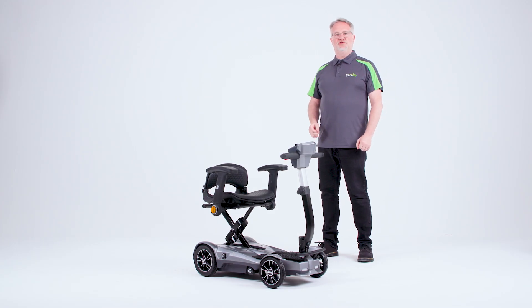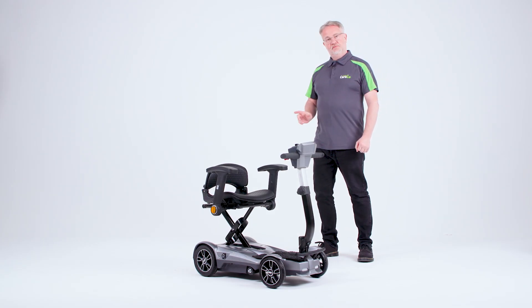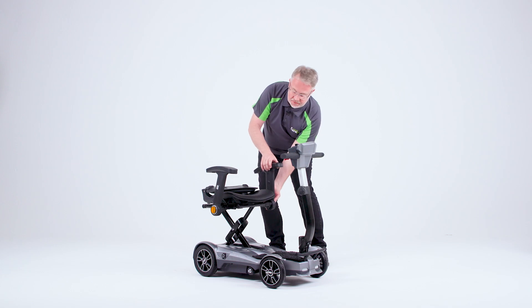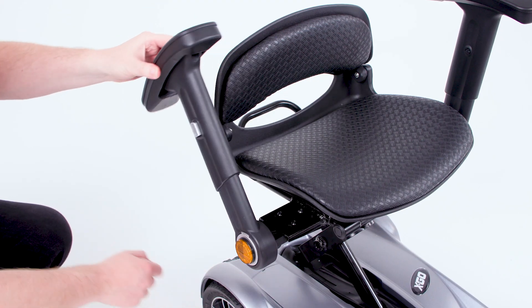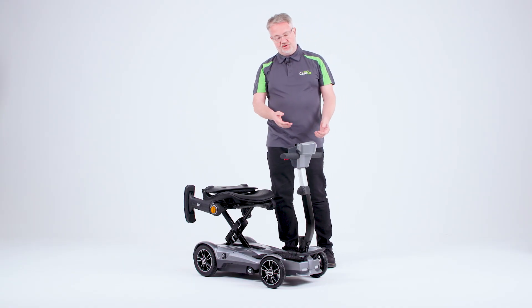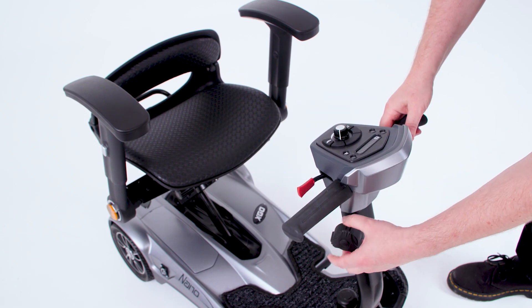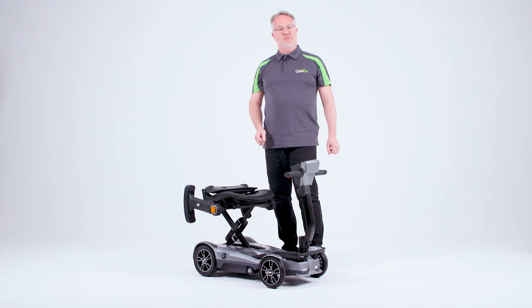In order to fold the scooter, there are a couple of items that you just need to move first of all. Firstly, we put the backrest down and then we can adjust the arms by pressing the button on the side and fold those flat as you can see. On the tiller, you may be able to leave it at the height shown. However, by simply loosening the tiller, dropping that down and re-tightening it, it then ensures it's as compact as it can be.